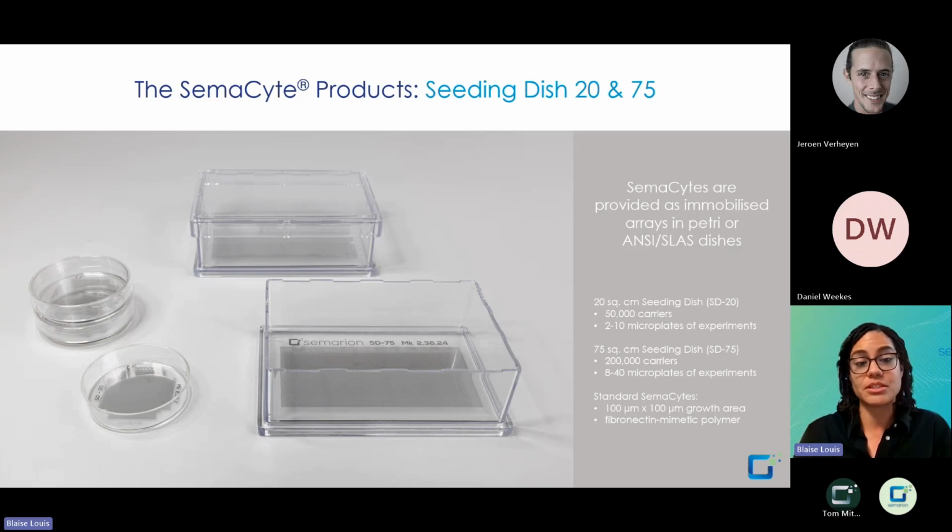As Joanne mentioned, standard SemaCytes have a 100 by 100 micron growth area and are coated with a fibronectin mimetic polymer, but there is some flexibility around the size and shape of the SemaCytes and the desired coating. We've been testing various other coatings, and recently we've looked at PDL and fibronectin for human iPSC-derived cardiomyocytes.